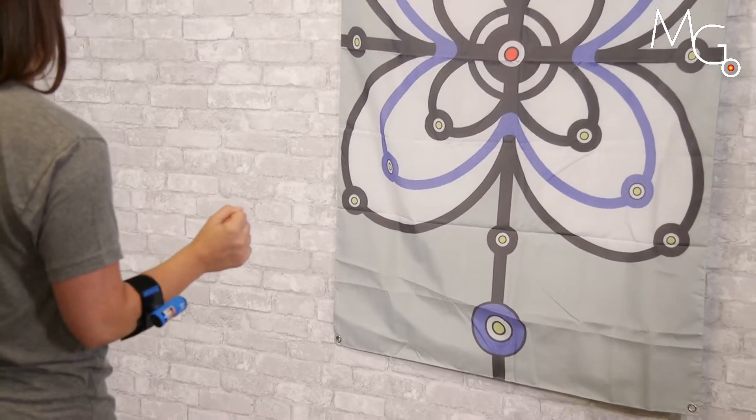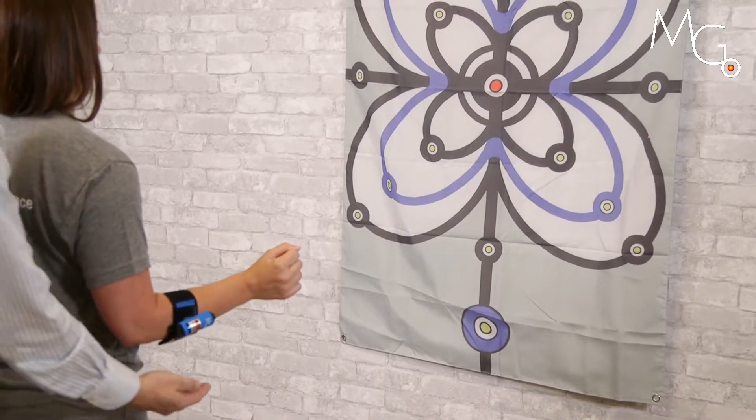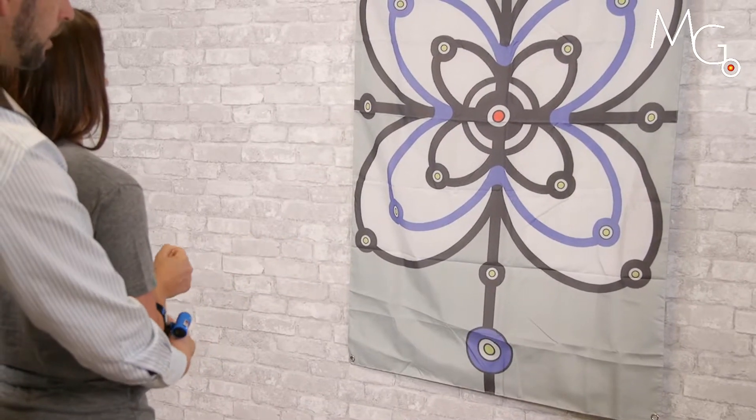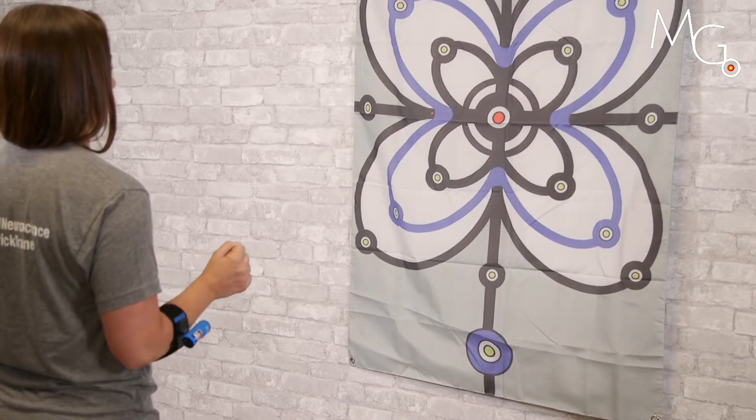This gives the patient immediate visual feedback on a faulty pattern that they can then correct, and then return. Keep that laser above the line the whole time.